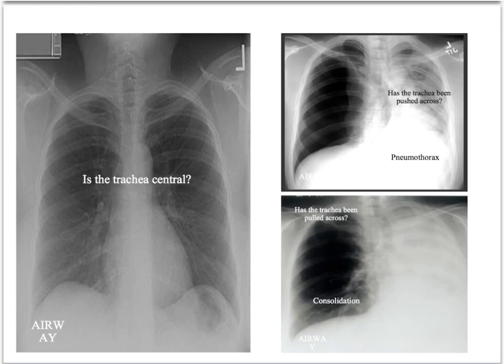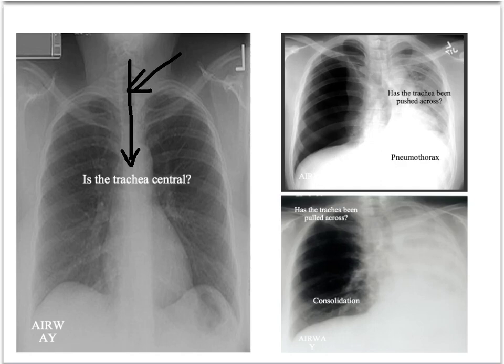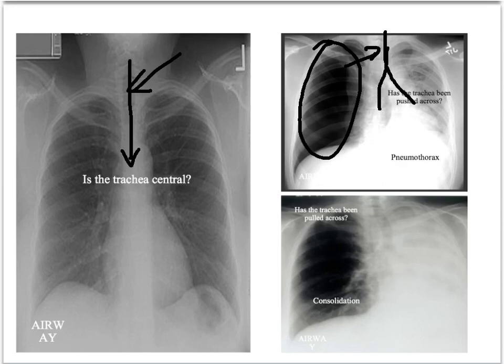Moving on to A — airway. The first thing you want to know is whether the trachea is central, in the midline, or has it been pushed or pulled across? In this example you can see the trachea running down the middle, equidistant between the two clavicles — that is a central trachea. In this other example, there is evidence of a pneumothorax, and as a consequence the pneumothorax has pushed the trachea across — you can see it running down and bifurcating over to one side.